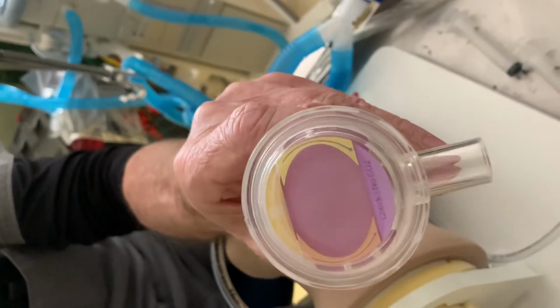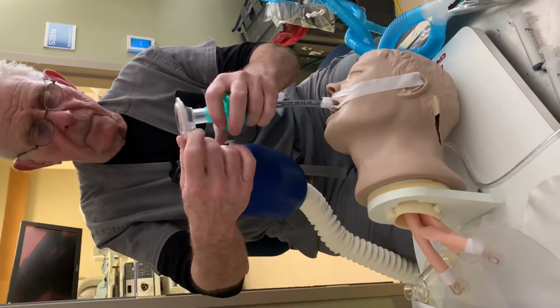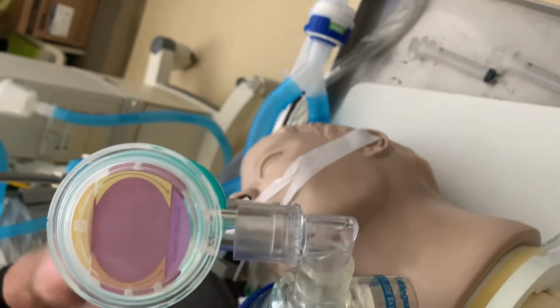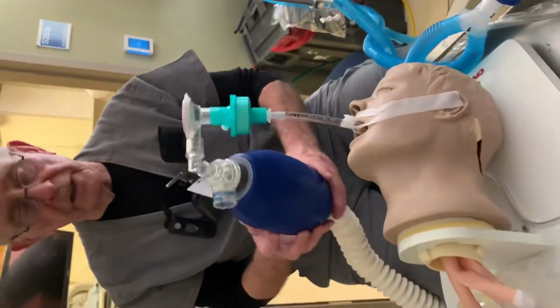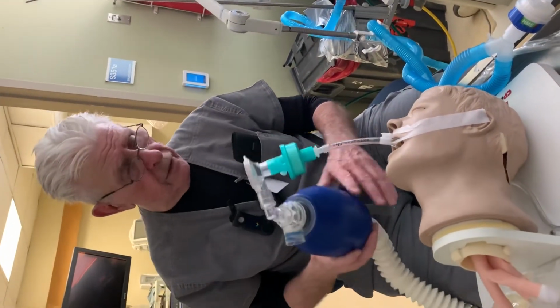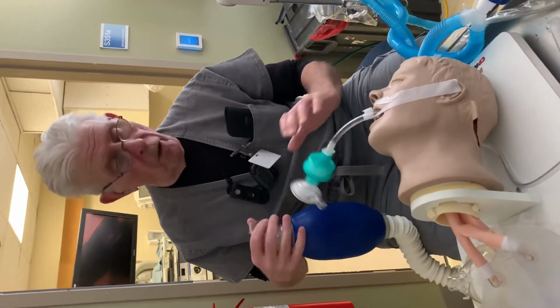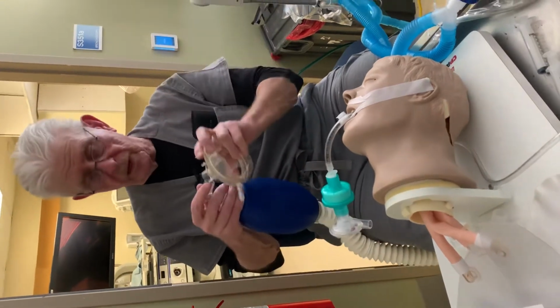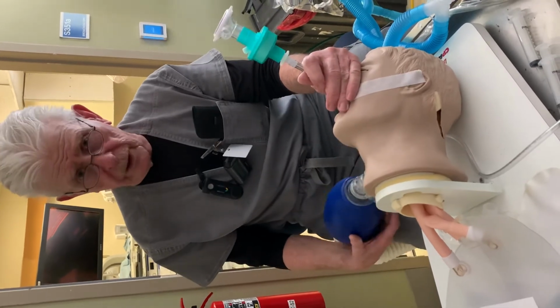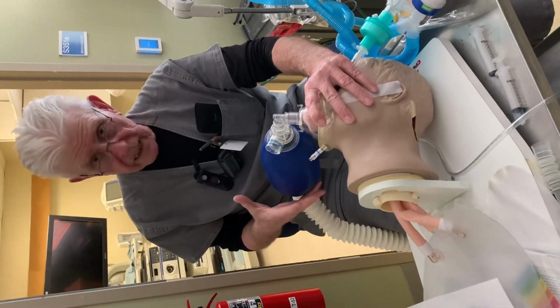If you were to connect this up, and you were bagging the patient, and it were to remain purple, that would be something for you to question whether this tube is in its proper place. And the immediate sequence then, once you put that in, is to listen to your bilateral breath sounds. Now, if that tube should happen to come out, you're obviously going to be calling for help before then. That's why you need the mask. If there's some doubt and you're not adequately exchanging air, we will pull this tube out and ventilate with bag and mask, such as this.